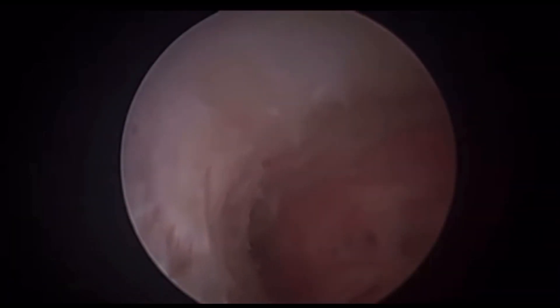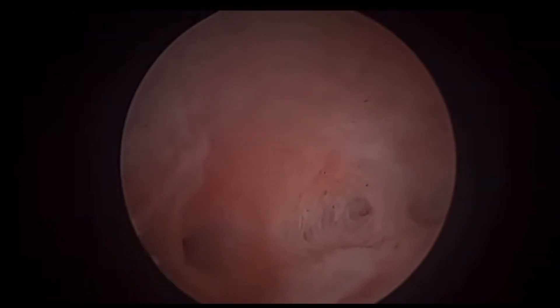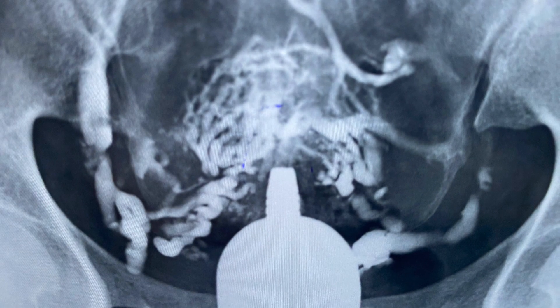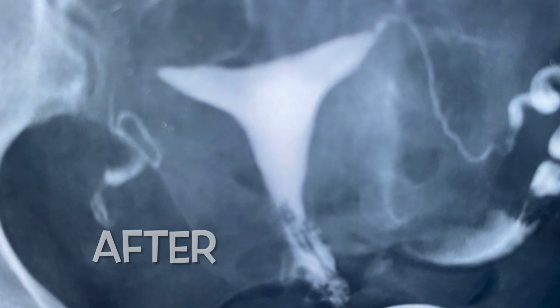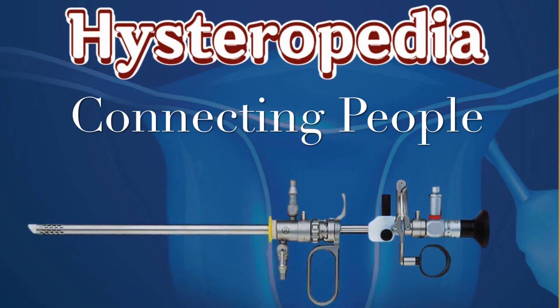My dear friends, I hope you enjoyed these steps and my tips and tricks to overcome the nightmare of Asherman's. Look at the endometrium — it starts to turn pinkish now. Let me share the result of surgery: that's before, and that's after surgery. Thank you very much. This is Osama Shaoki from Cairo, Egypt.